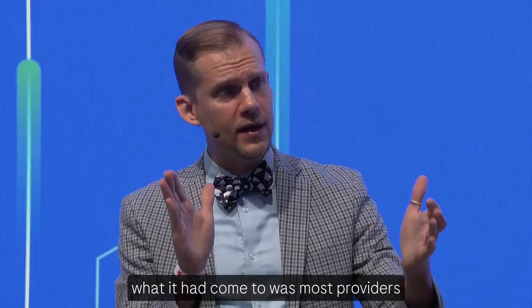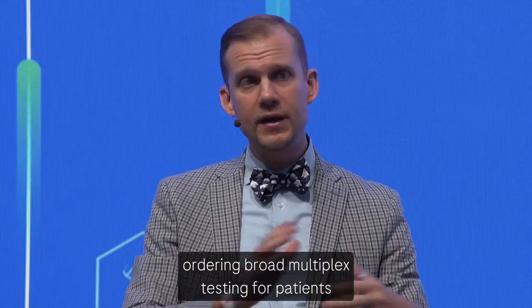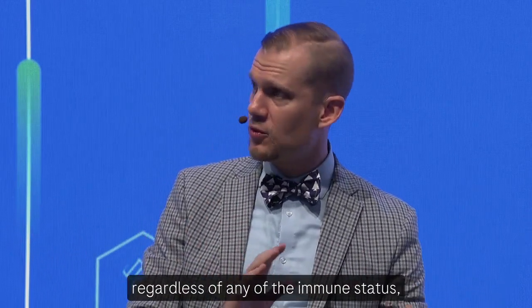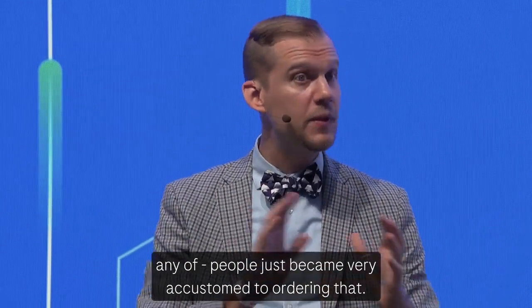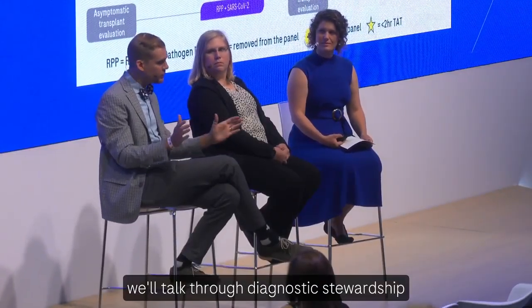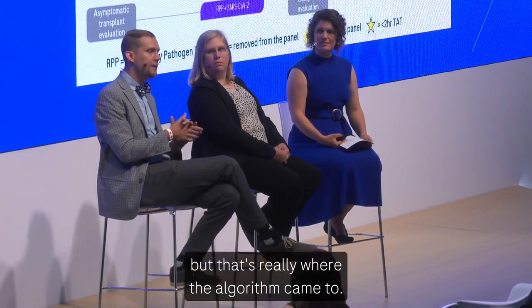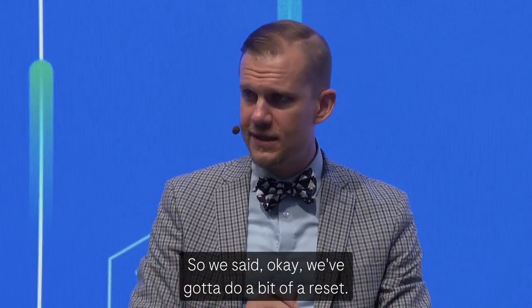Quite honestly, what it had come to was most providers ordering broad multiplex testing for patients who were being admitted to the hospital, regardless of immune status. People just became very accustomed to ordering that. And we'll talk through diagnostic stewardship and how that matters later, but that's really where the algorithm came to. So we said, okay, we've got to do a bit of a reset.